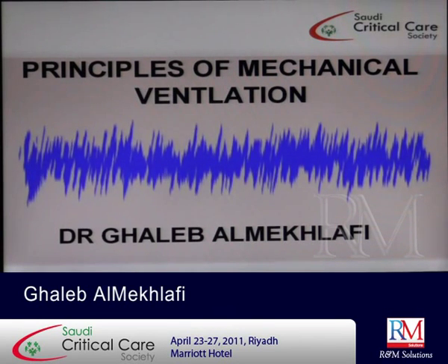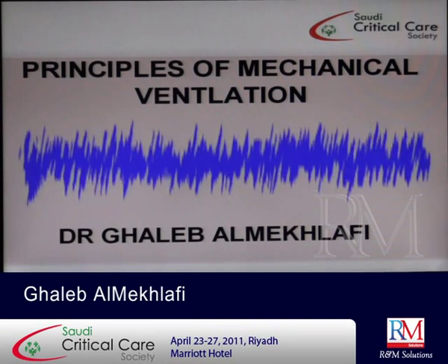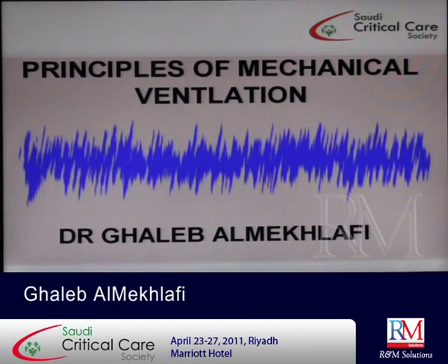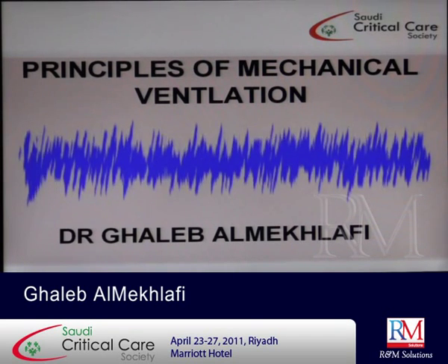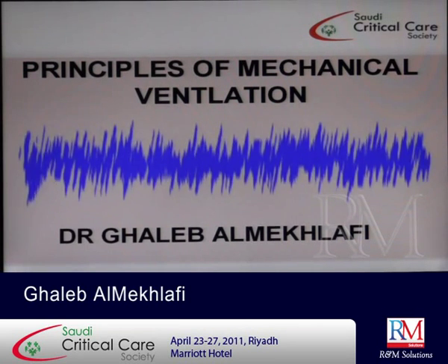ventilation. Now, if I can push the air directly into the airways, so during inspiration there will be a positive pressure, actually not negative pressure, and this will inflate the lung and expand the chest wall and push the diaphragm down. So it's the opposite process. So I started during inspiration with positive pressure. This is called positive pressure ventilation, okay.